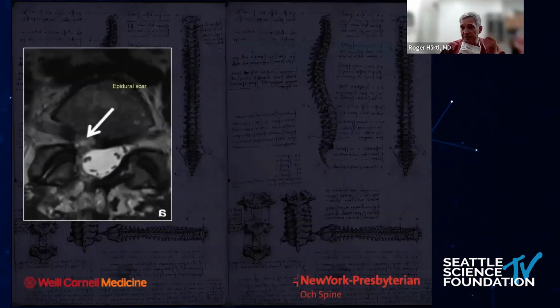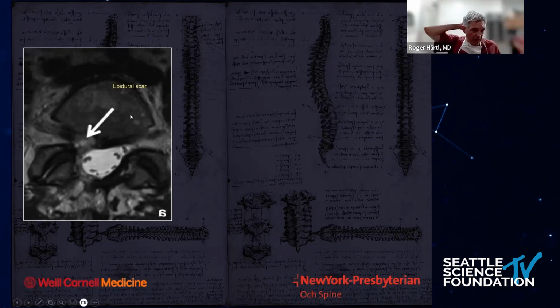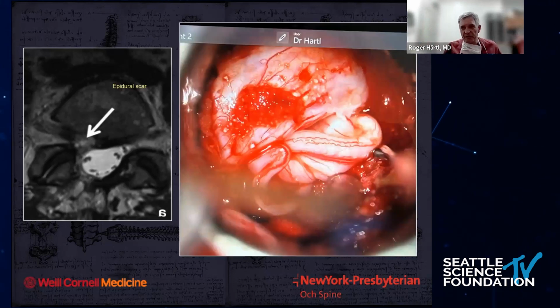And there are ways to fix CSF leaks through tubes. Many of you are familiar with that. I'll show you what I do typically. But again, a lot of it is patient selection, right? So somebody like this patient here who had previous surgery, and you can see there's a lot of scar tissue here. So if you have to go back and do a fusion for whatever reason or any other operation, it would be great to avoid, obviously, the area where the scar tissue is, where there's a higher risk of a leak.